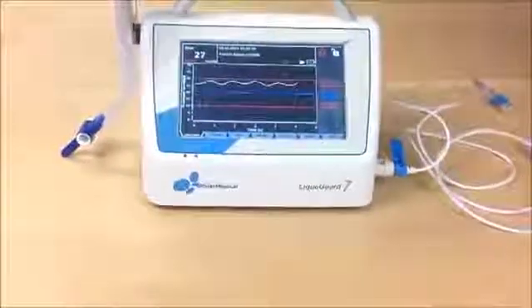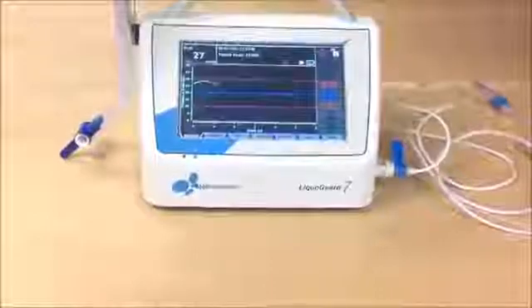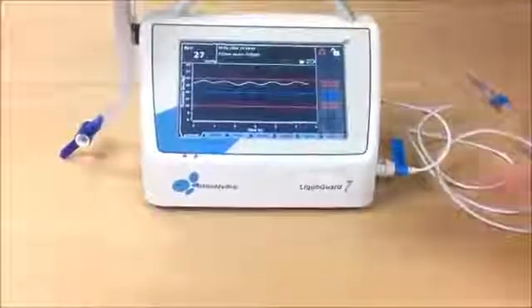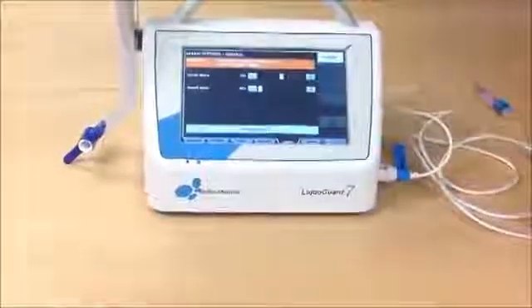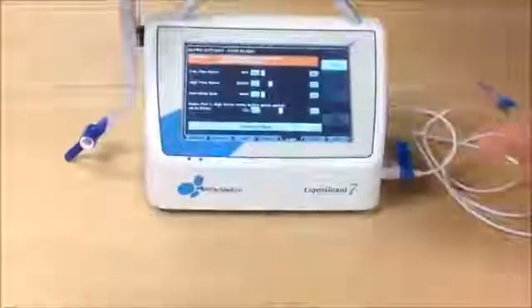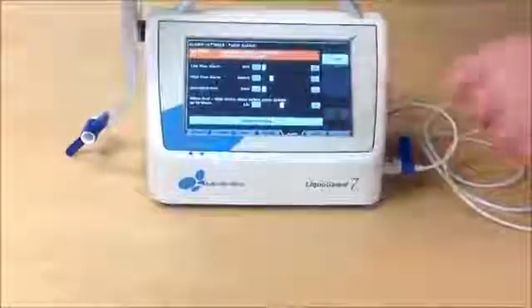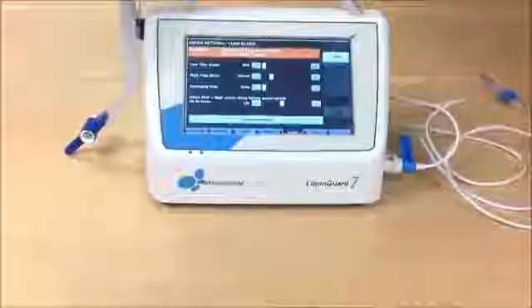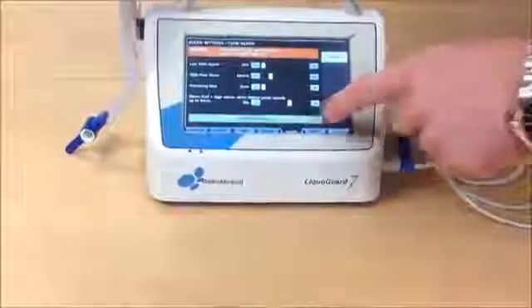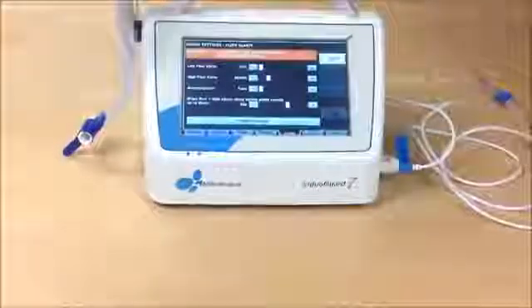The same with the max speed of the pump. The pump speeds up after some delay, the delay which you can adjust here. The delay now is 12 seconds, which is pretty small. 30 seconds is the default setting.